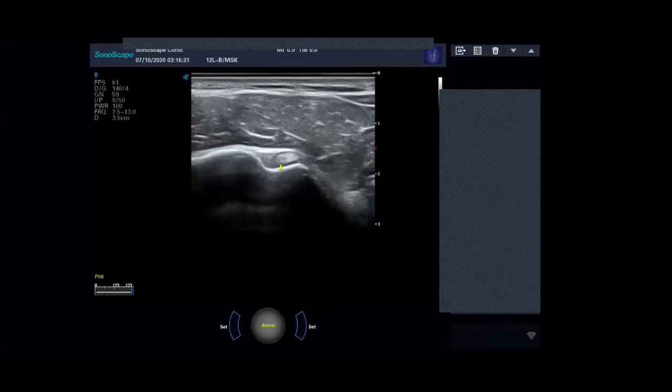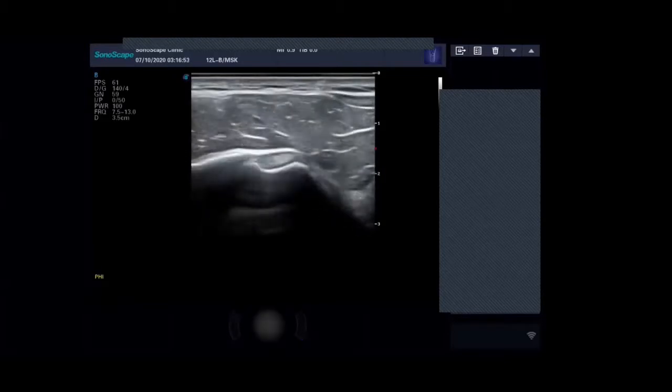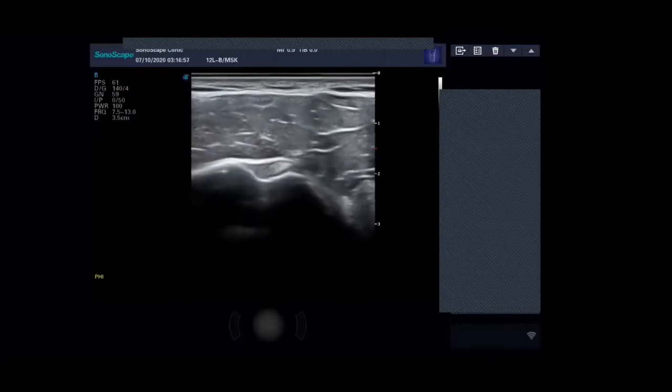Can you see how he's using his small and second finger to stabilize the probe and keep himself in place? If you're just trying to grip that with a free hand, you're just going to slide all over the place. It's really difficult to keep on the structure. So using your hand as a guide is incredibly helpful. Yeah. All these tips are very easy to get across in a face-to-face practice session. A bit difficult here, but we can do as much as we can.